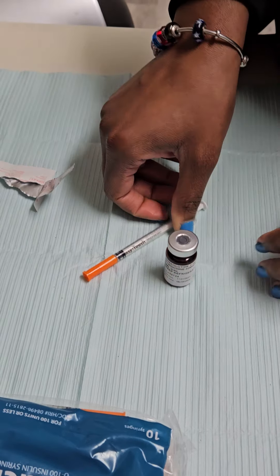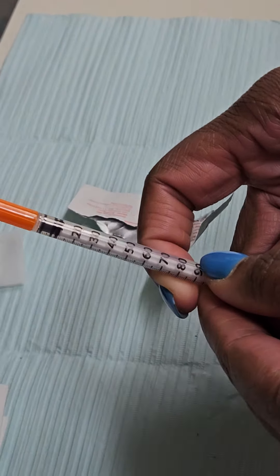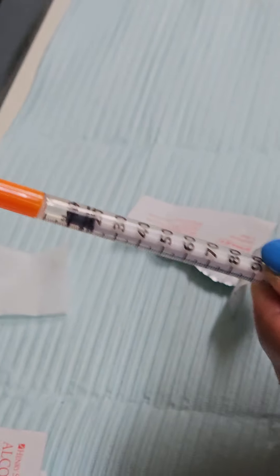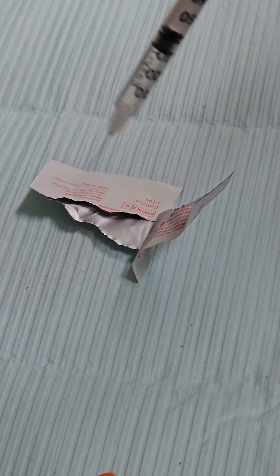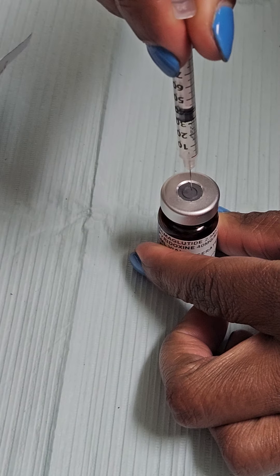Next thing we're going to do, we're going to take our needle and draw back the amount of medication we're going to give — today we're giving 30 units. We're going to take our cap off our needle and inject it right into the rubber part of the medication vial.